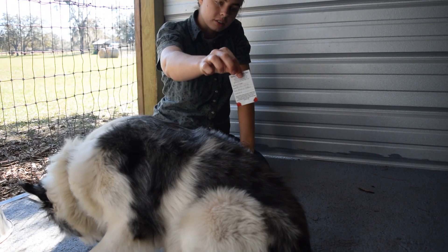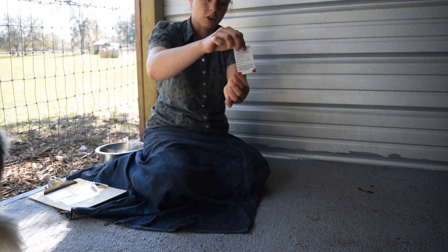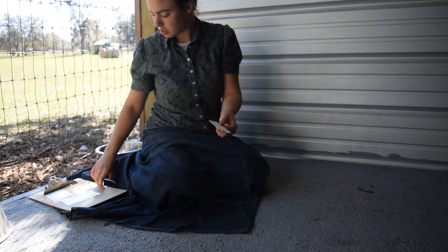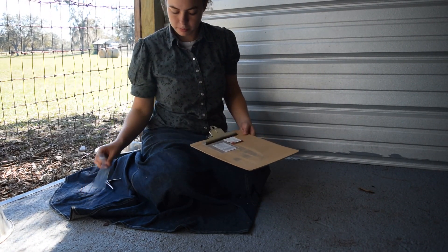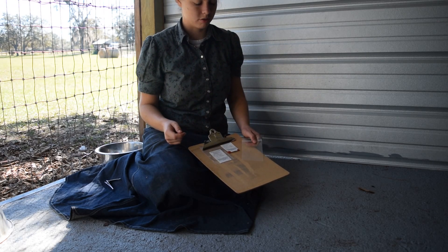They say to fill both circles at least halfway. As you can see, I was able to get a good sample — this time she filled them all the way. Now that needs to air dry for 15 minutes or so. I'm just going to put it on my clipboard and let it dry there, and then it'll go back into this plastic envelope and I'll send it in with the form and the appropriate sheet to the lab.